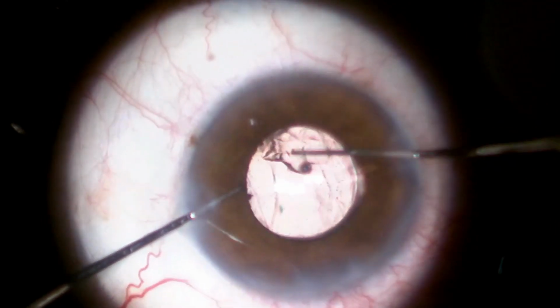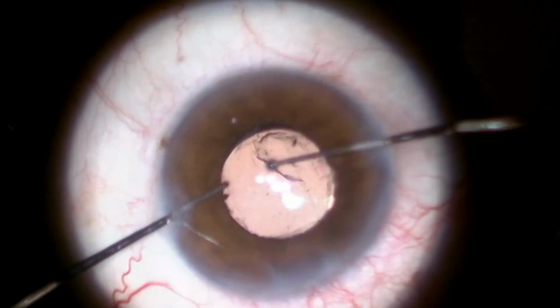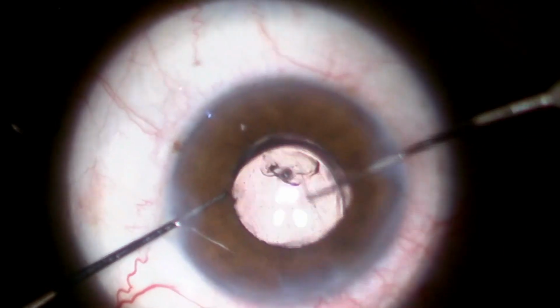The residual capsule is pretty tough as the case is already 2 years old. So the lens is stable in the sulcus.